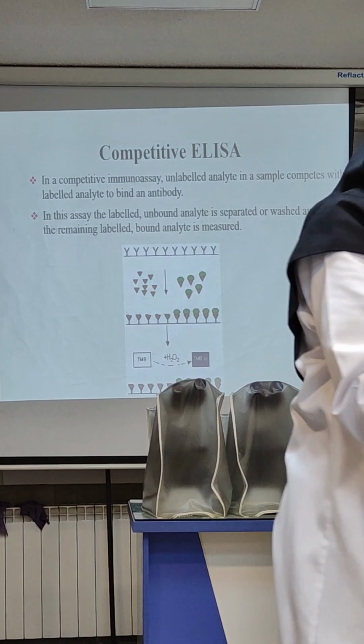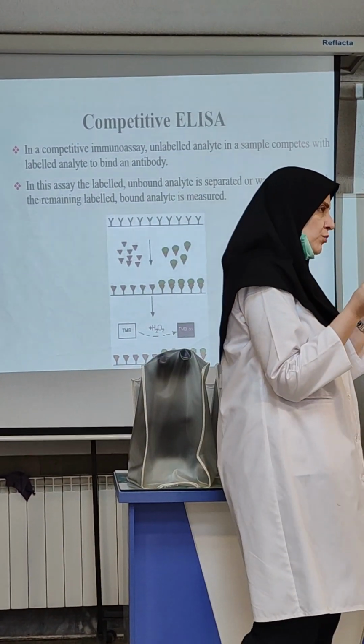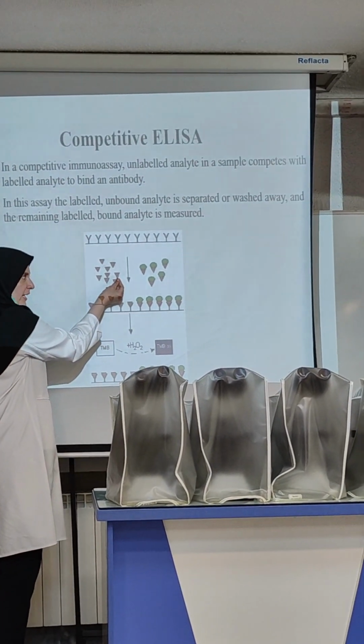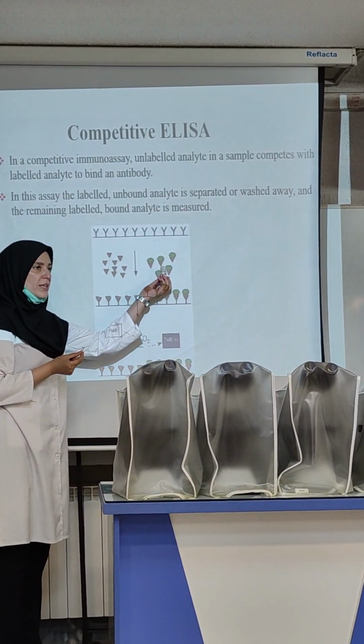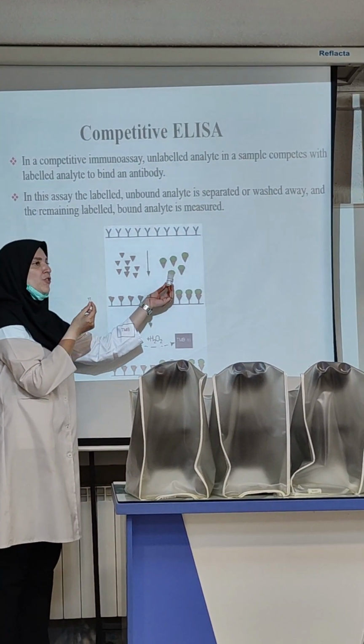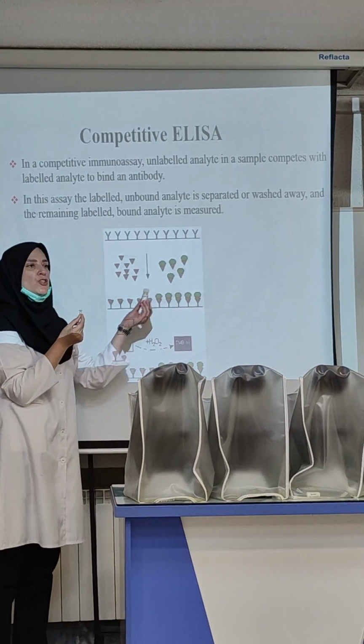You know, for example, in a laboratory, you want to measure the concentration of T3. At first you add a serum, and also take the tracer. Tracer is, for example, if you measure T3, the T3 bound to the HRP.